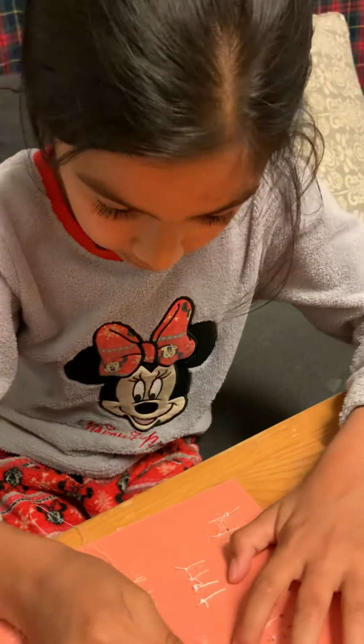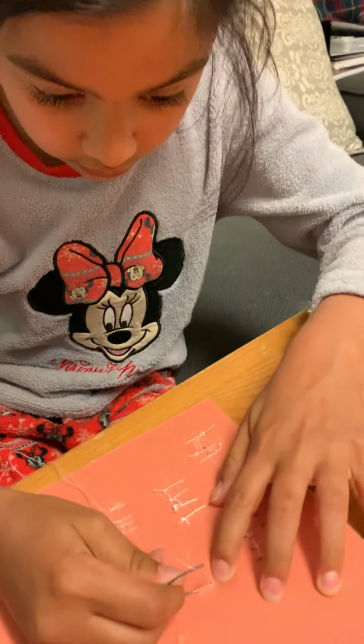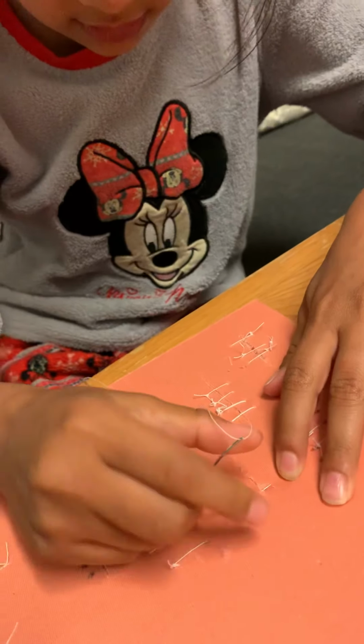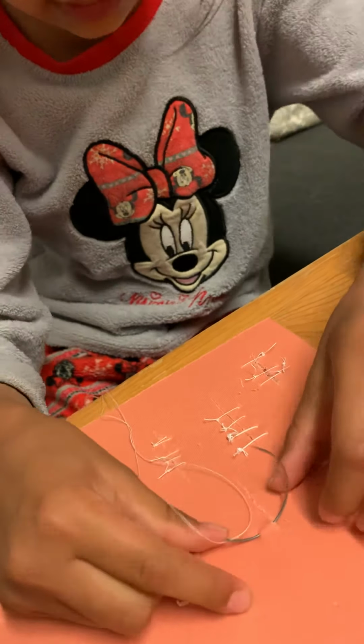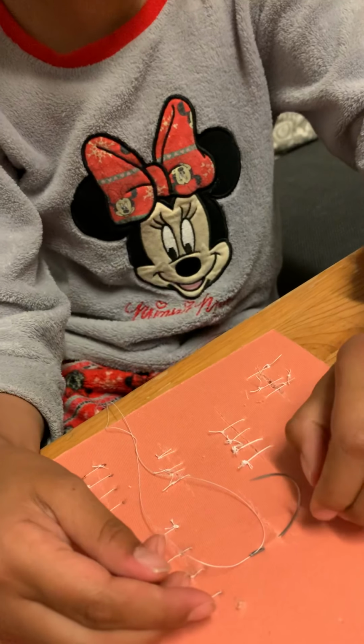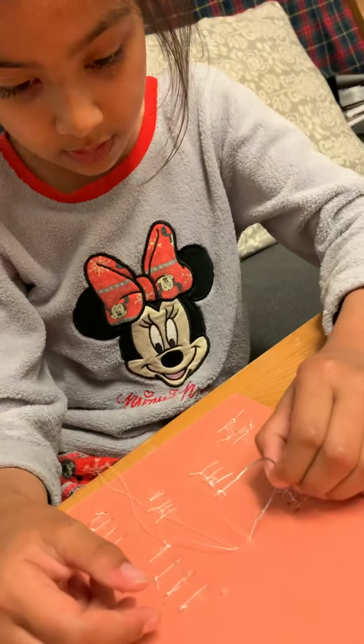Simple interrupted suture. So first we take the needle. So this is a skin? Yes. Pull it through the skin. It's on practice. And thread it through.